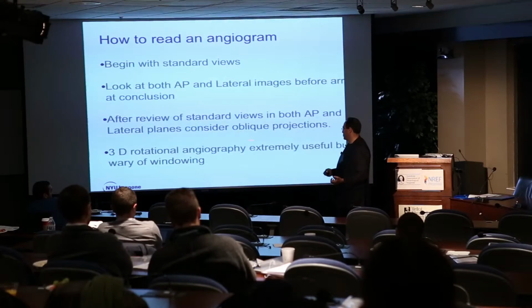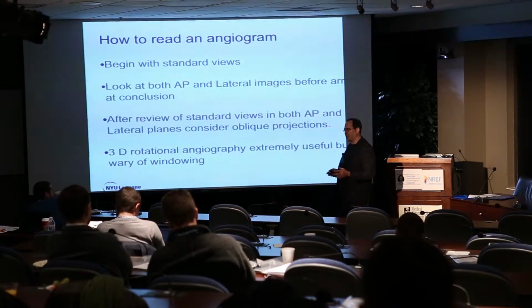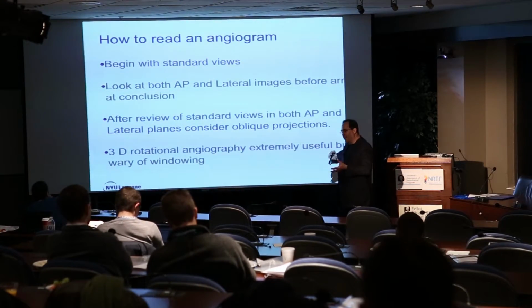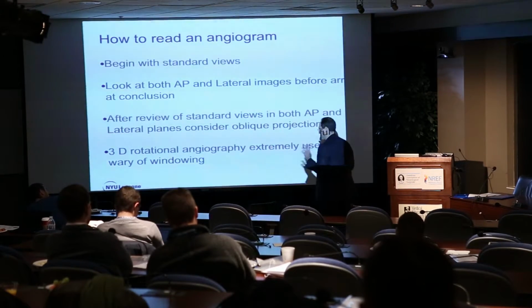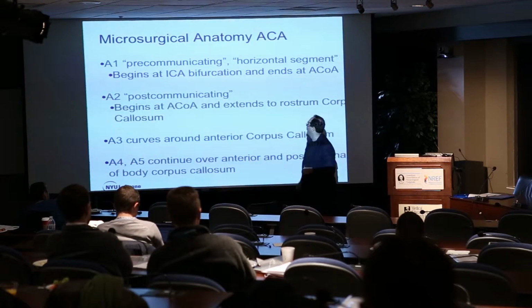But there's one caveat about them. They are limited by whoever created them. Those images can be manipulated and windowed, and so you may lose an infundibulum, or sometimes small aneurysms. If you window it, you can window out the vessel. You can window out parts of an aneurysm, a small dome. So be wary when you're looking at 3D angios that somebody has created who may not be the person doing the procedure, and they're trying to make a nice image for you to look at, but you may lose some information in that. So just remember that.